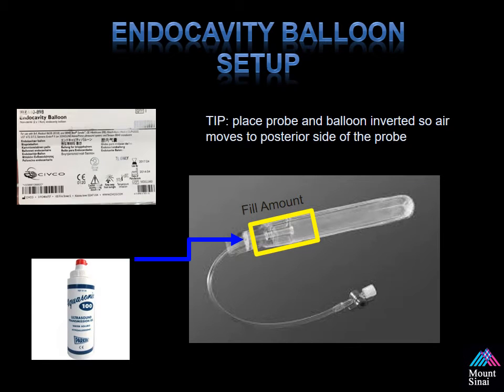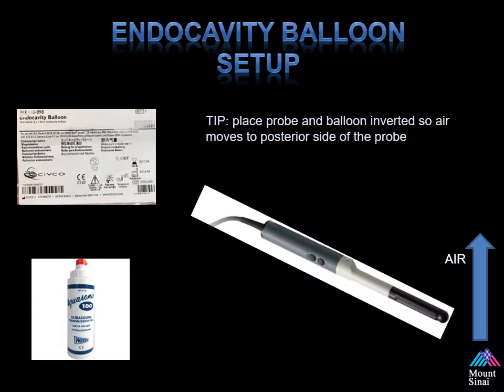The first step in getting ready for a transperineal prostate biopsy is placing the endocavity balloon on top of the ultrasound probe. See that yellow box? Just add that much ultrasound jelly — too much is going to make a mess. Also place a little jelly at the tip of the probe. When placing the endocavity balloon on top of the ultrasound probe, please do that in an inverted fashion. This allows the air to rise to the top on the bottom side of the probe, away from your imaging crystal, making it easier to avoid any artifacts during the procedure.